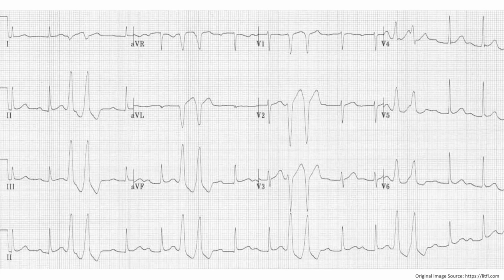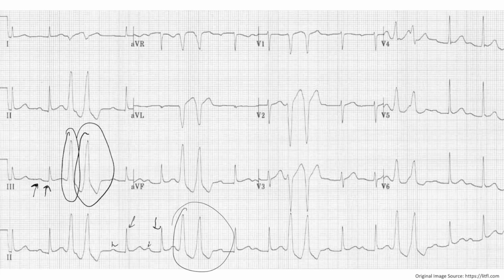Now here you can see a P wave followed by a QRS. And then notice these bizarre looking QRS complexes with no preceding P waves. Again, you have two normal QRSs with preceding P waves, and then you have two bizarre-looking QRS complexes. So these would be examples of couplets, ventricular couplets. And this would be another example for PVCs.